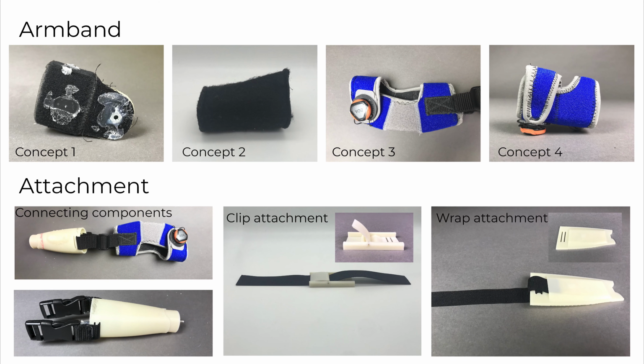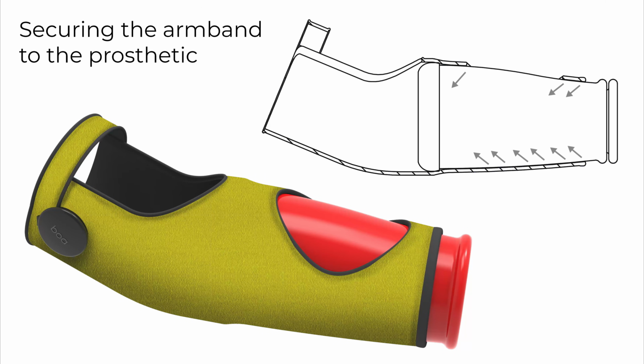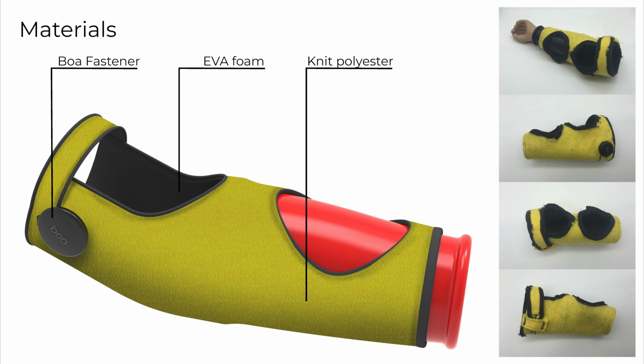We tested various armbands that we can connect to the prosthetic to reduce this pressure. And we tested a variety of armbands that acted more as sleeves on the arm with attaching the band to the prosthetic with snaps. Our final design for the armband uses pressure fit to keep the prosthetic attached to the band, which reduces pressure on the residual limb as confirmed by Dr. Renate. The armband is made of EVA foam, brushed knit polyester, and a boa fastener, which is a common way that prosthetics are secured to limbs.